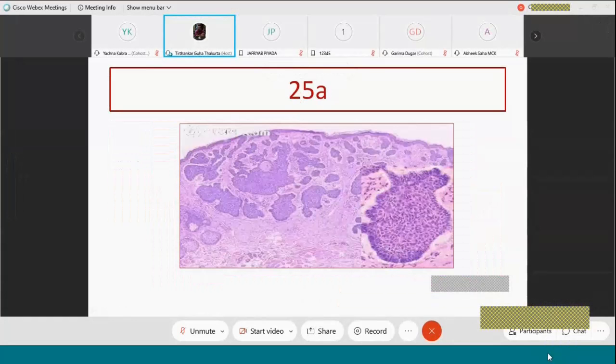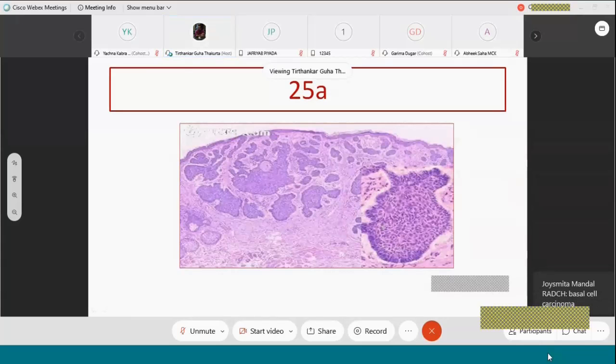This is also a skin tumor which looks more blue in color, and the cells come down forming dumbbell shapes. You can see that the outer cells are arranged parallelly and inner cells are haphazardly arranged. This is the typical appearance of basal cell carcinoma.